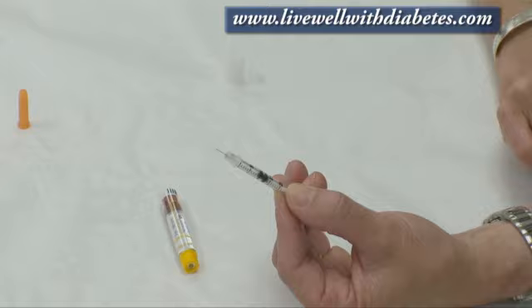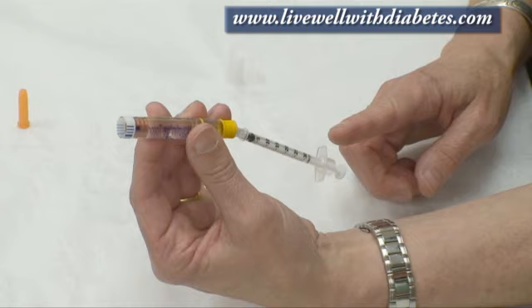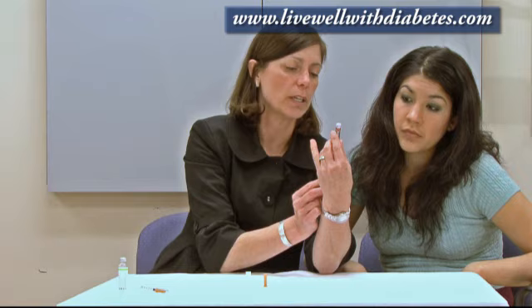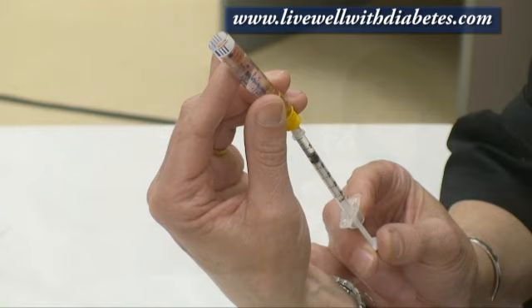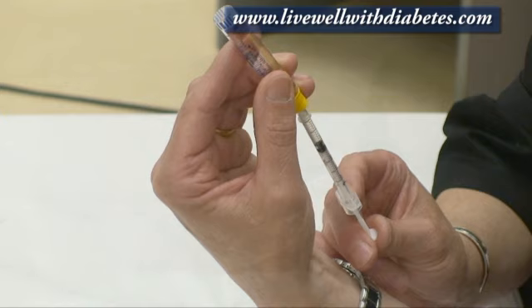To take insulin out of a cartridge, I put the needle into the cartridge holder, then use counter pressure with my index finger against the flange, hold with my two middle fingers, and pull the insulin down. I pull down once — often there's a little air, so I push it back up and try a second time. The second time I pull past number 10, then push the plunger up until it matches exactly with number 10. Then I hold the barrel and pull the needle out of the clear cartridge.